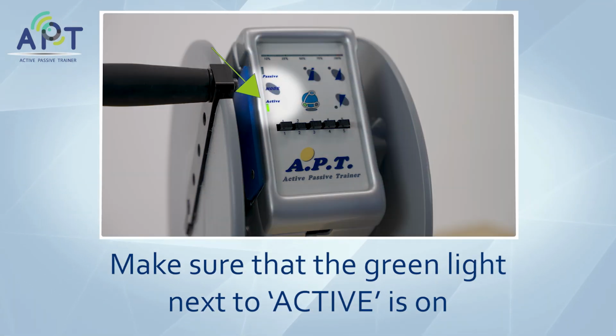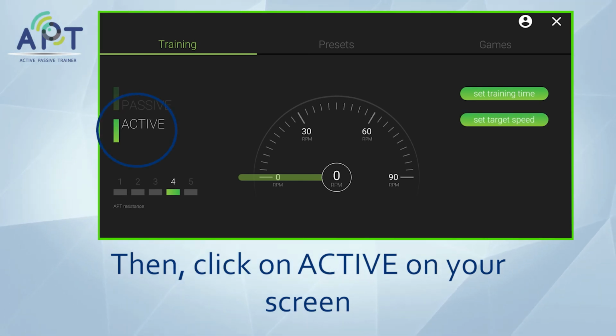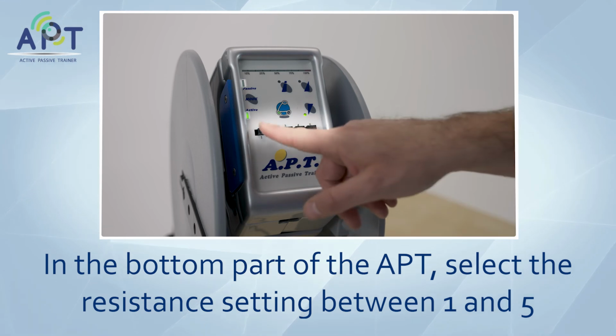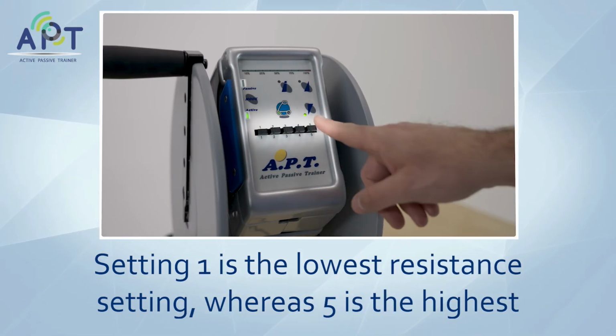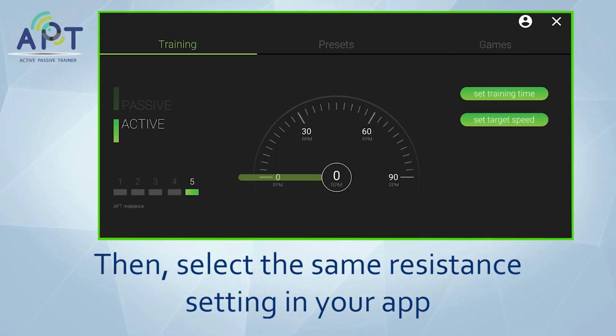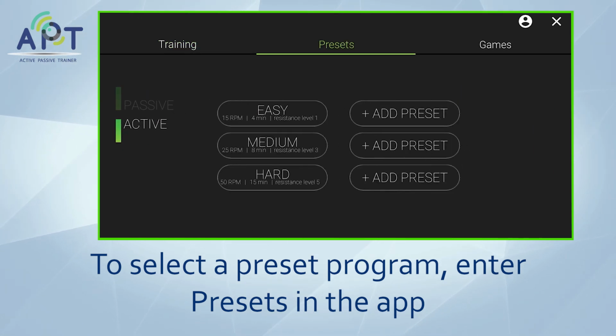Make sure that the green light next to Active is on. Then, click on Active on your screen. In the bottom part of the A.P.T., select the resistance setting between 1 and 5. Setting 1 is the lowest resistance setting, whereas 5 is the highest. Select the same resistance setting in your app. To select a preset program, enter presets in the app.